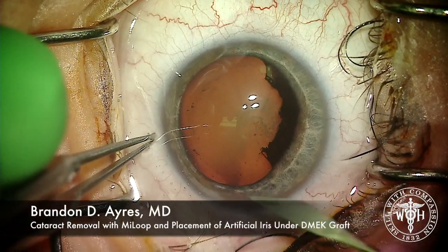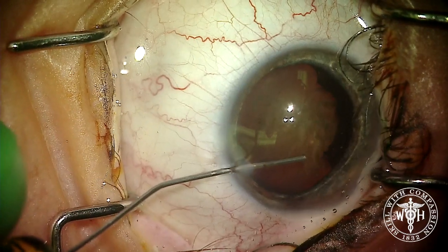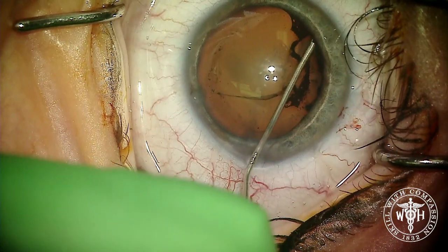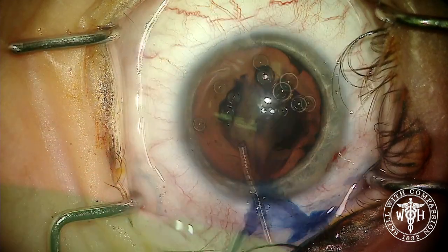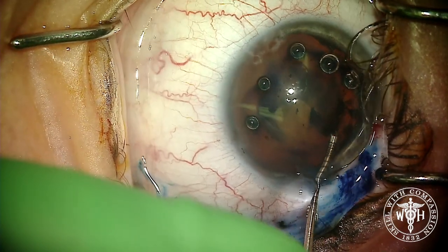This is a pretty challenging case tackled in the operating room. This is a woman with a large dilated or atonic pupil, posterior synechia, status post DMEK, who has a cell count of only about 600. We're going to be tackling a relatively mature cataract as well as placing an artificial iris.